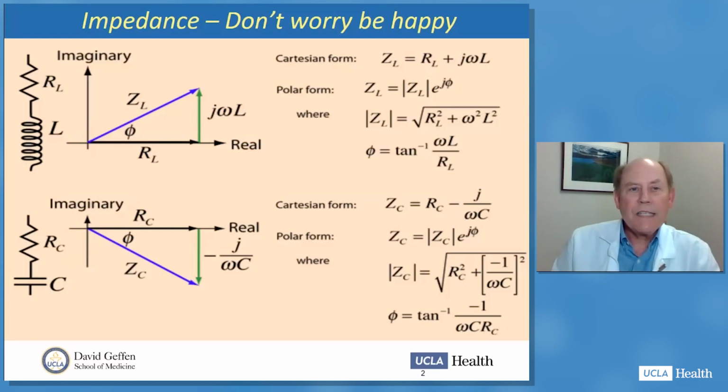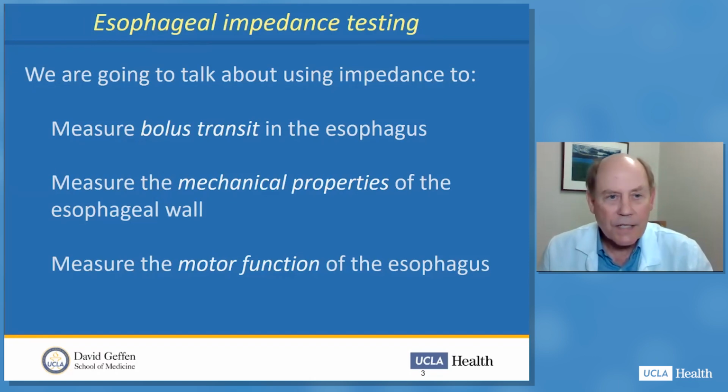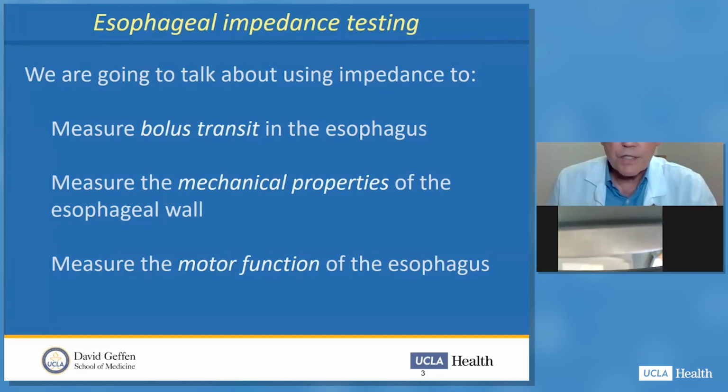We're going to talk about impedance tonight. And as I say when I present this topic, don't worry, be happy. So, esophageal impedance testing. This is what we're going to do. We're going to talk about using impedance to measure bolus transit in the esophagus, to measure the mechanical properties of the esophageal wall, and to measure motor function of the esophagus. So those are the three areas that we're going to endeavor to understand better tonight.